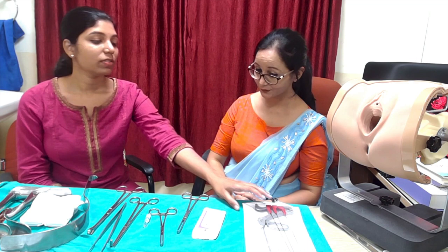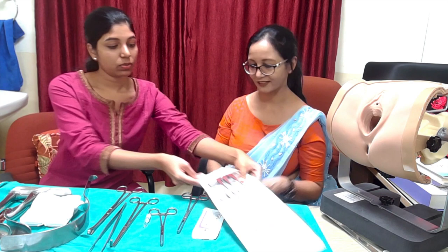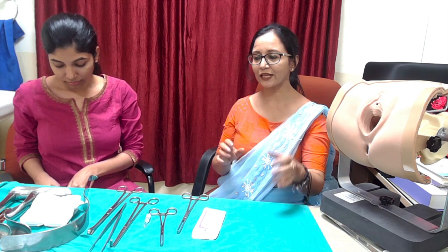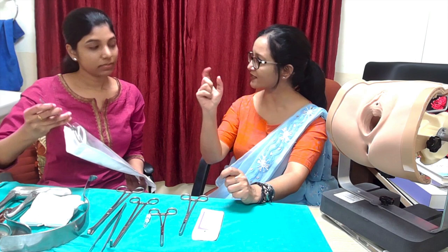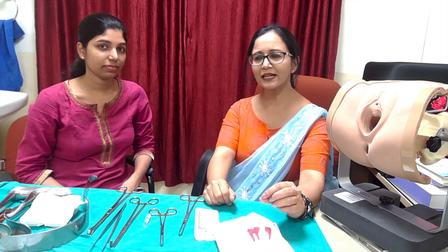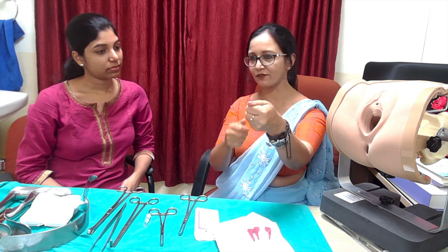The key instrument for sacrospinous fixation is the Scorpion device. Previously, I tried long needle holders from laparoscopic sets and Shirodkar needles, but found it very difficult to maneuver a curved needle in that deep space. The instruments kept slipping, damaging the sacrospinous ligament — which in older patients with prolapse can be quite thin and atrophic — and risking damage to nearby vascular and neural structures.